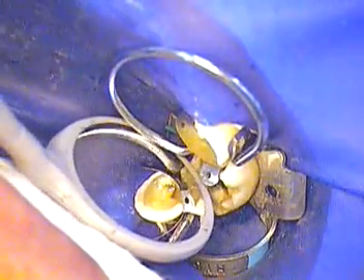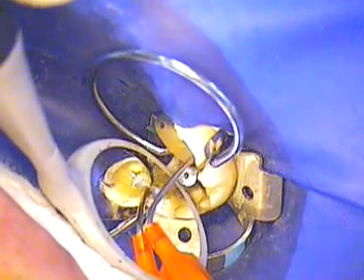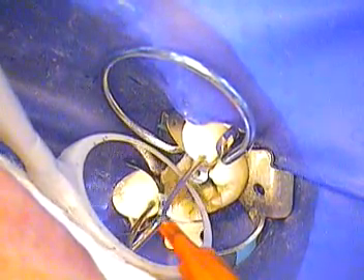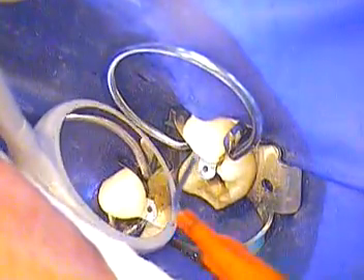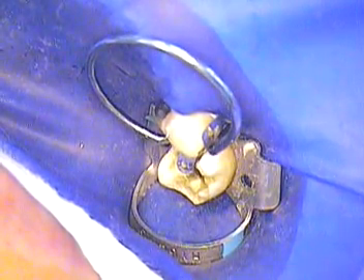This is the first of two — tooth number 29 — and we're going to go ahead and build this tooth up. I've got to get this material to stick to it. We're going to extrude out our material. I'm using reflective vision right now. We'll fill that all the way up — make sure we get it right on the enamel, that's the key. Make sure we get the enamel. That looks good. We're just going to let that set — and that is the core buildup part.